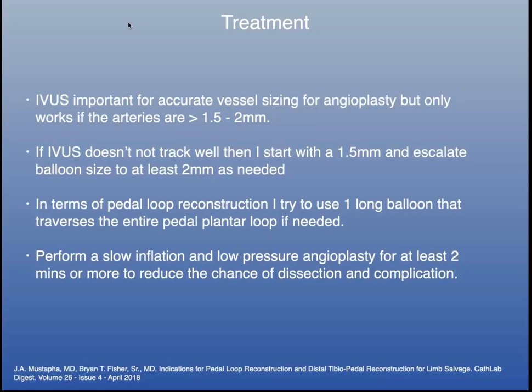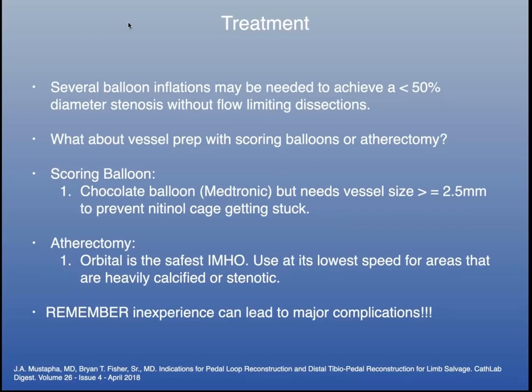And you want to keep these balloons up. Below the knee, most people will say 2 minutes, maybe a little bit longer. Below the ankle, I think you want to do 2, 3, maybe 4 minutes. You really need a prolonged inflation. So obviously below the ankle, you're going to be doing several balloon inflations sometimes to achieve less than 50% diameter stenosis. In pedal loop interventions, you're not going for the perfect textbook result. You're going for less than 50% diameter stenosis without any flow limiting dissections.